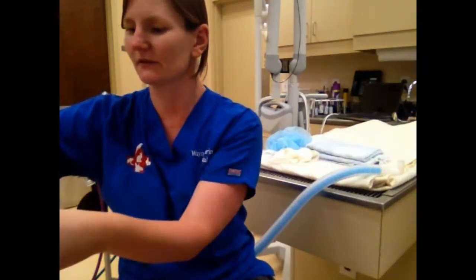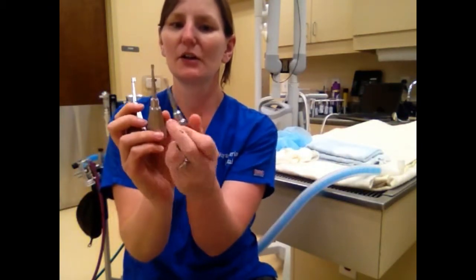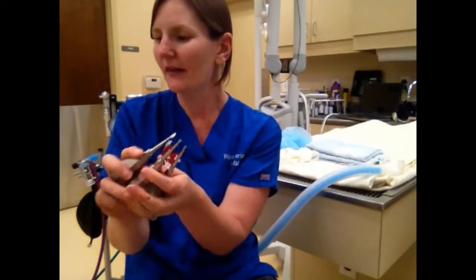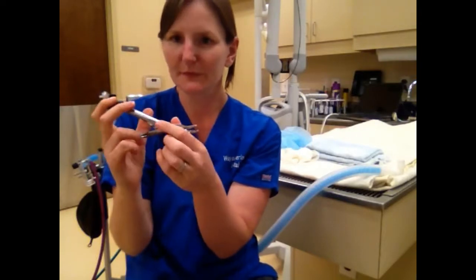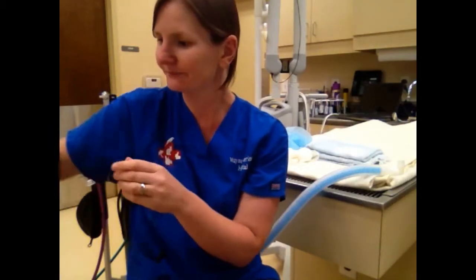Some of the other instruments we may need during a dental are to help with extractions. So we have elevators. We've got an example of some different sizes there, and these are used to raise the tooth from the tooth socket to aid in extraction. And then once those have been used and the tooth is raised, we can use our tooth removing or extraction forceps. These attach to the tooth and help to extract it.